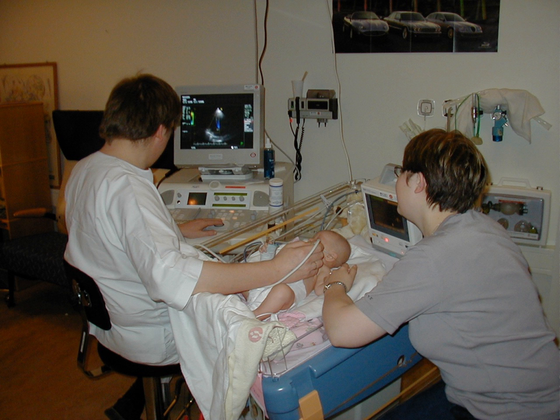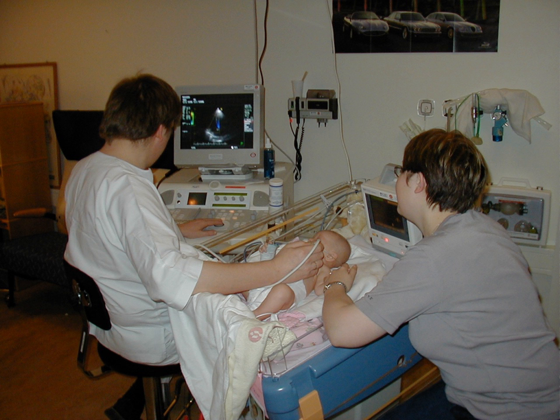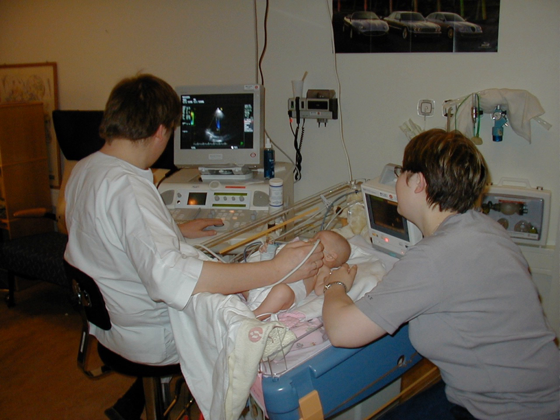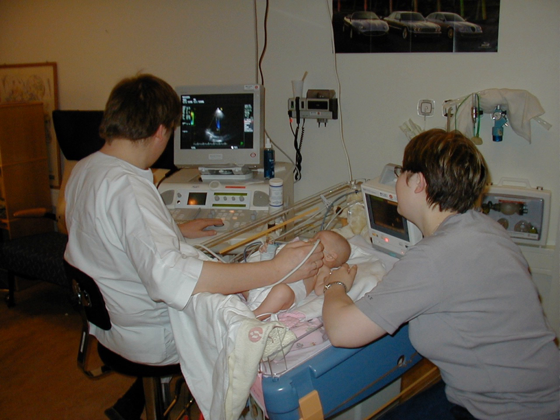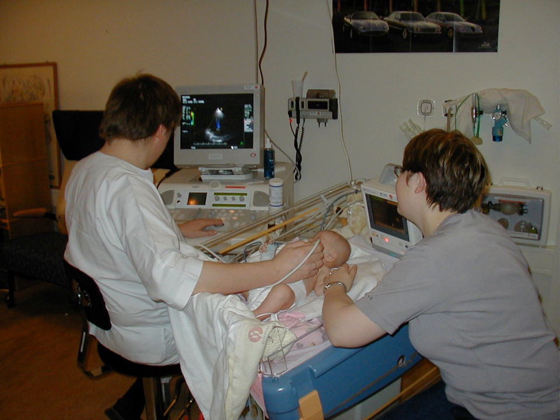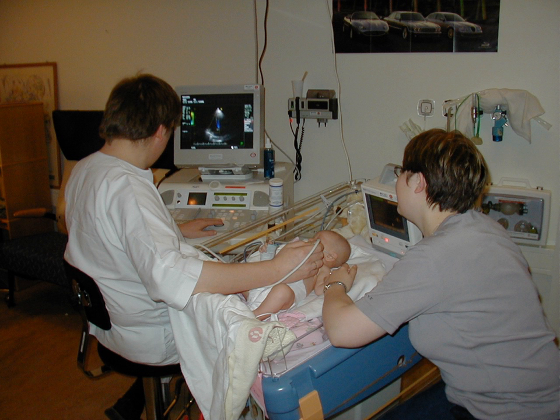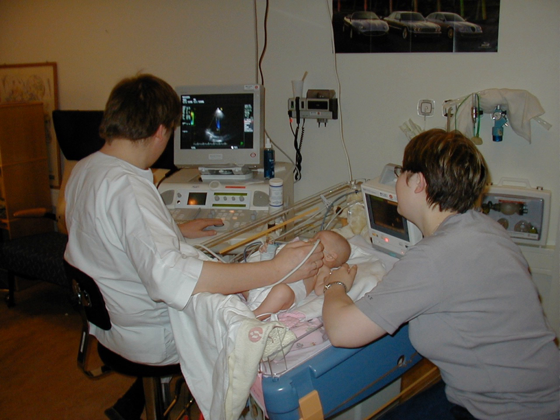Other image types can display blood flow, motion of tissue over time, the location of blood, the presence of specific molecules, the stiffness of tissue, or the anatomy of a three-dimensional region. Compared to other dominant methods of medical imaging, ultrasound has several advantages: it provides images in real time, is portable and can be brought to the bedside, is substantially lower in cost, and does not use harmful ionizing radiation. Drawbacks include limits on field of view, need for patient cooperation, dependence on physique, difficulty imaging structures behind bone and air, and the necessity of a skilled operator.